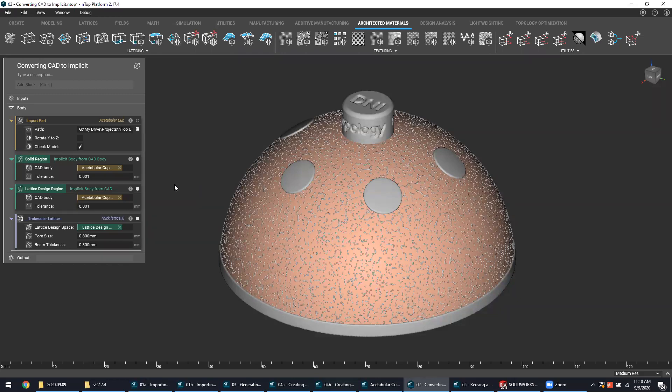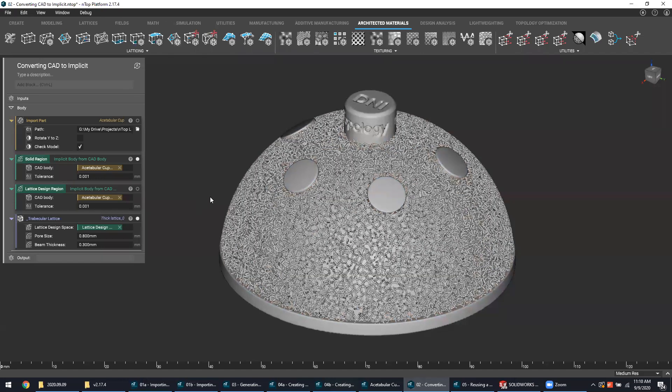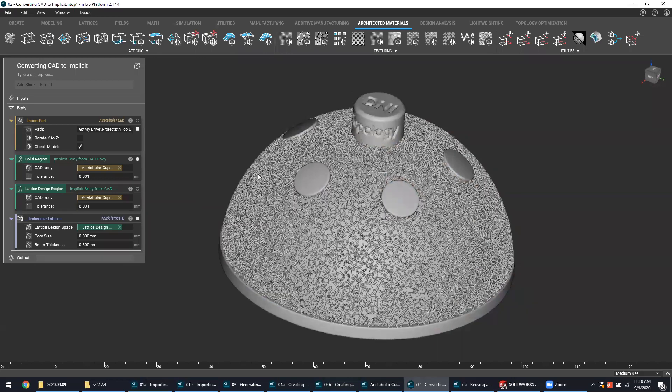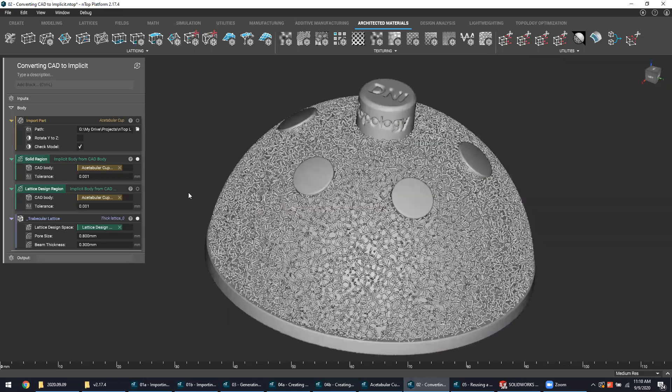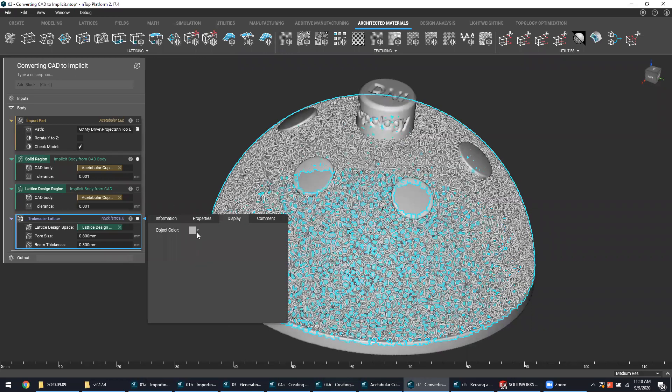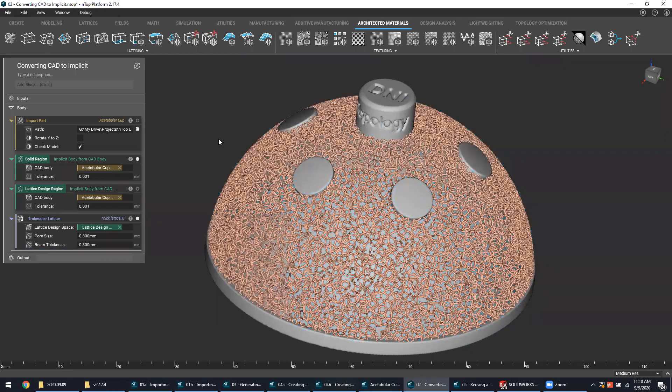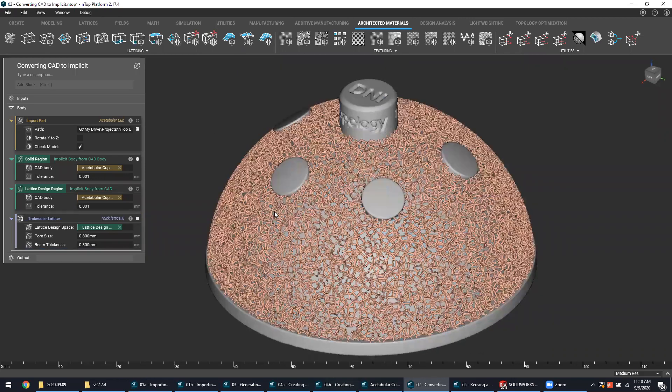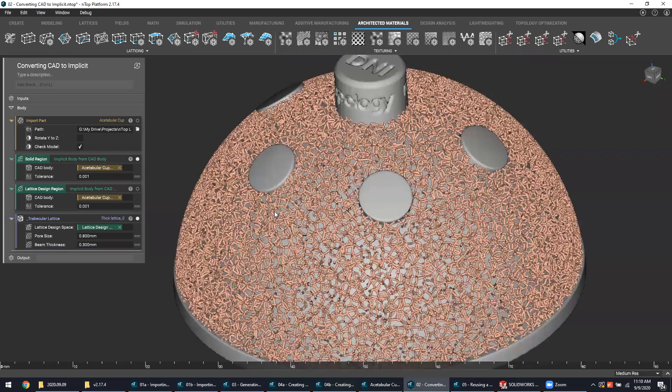We can see that it's now finished, and we can see that lattice structure generated where that lattice design region was. If I change the color of that super quick, you can see how it stands out from the solid region behind it, just a little bit more visual clarity there.